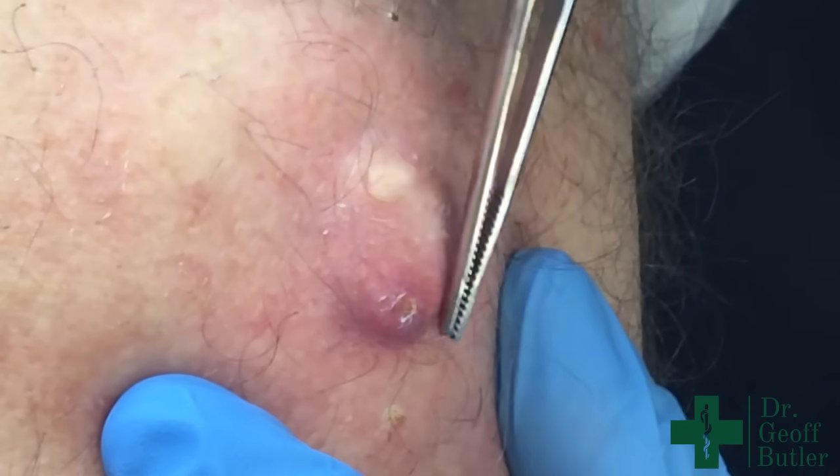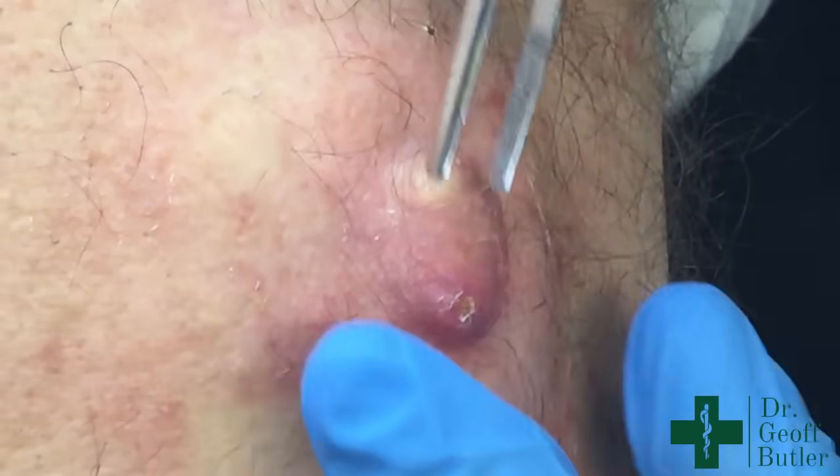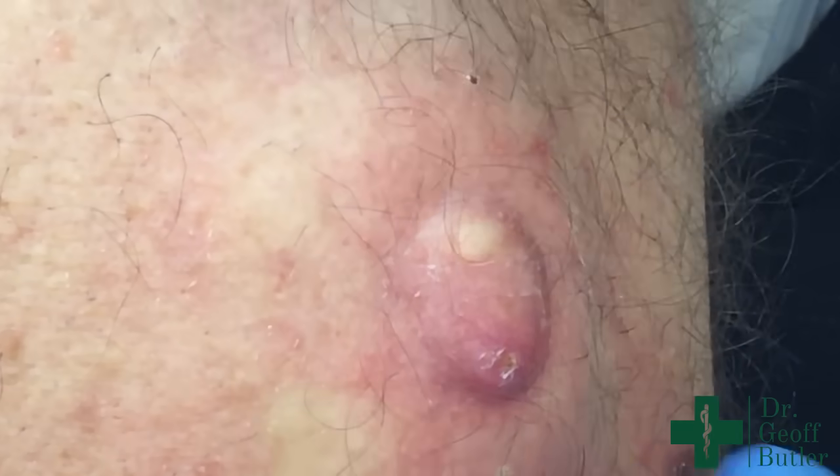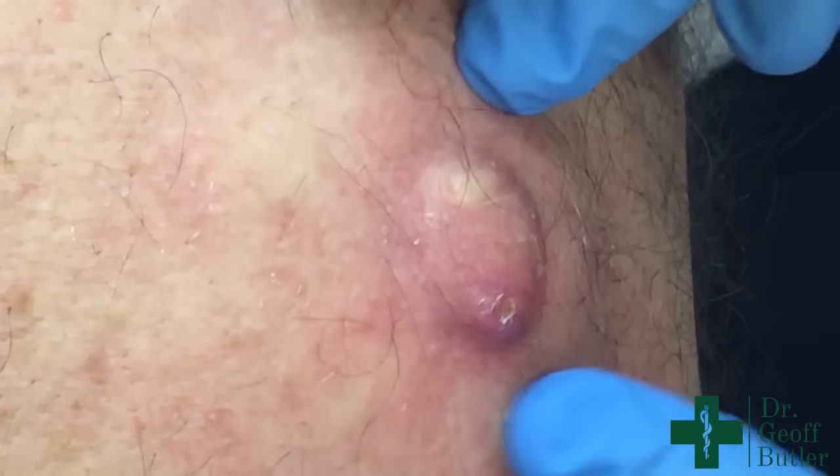This patient is coming in for removal of lesions on the left upper mid-back. This has all the characteristics of an epidermal or epidermoid cyst. We've put some anesthesia in around here.